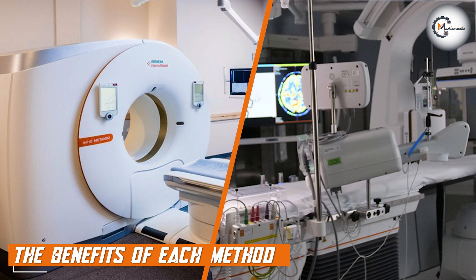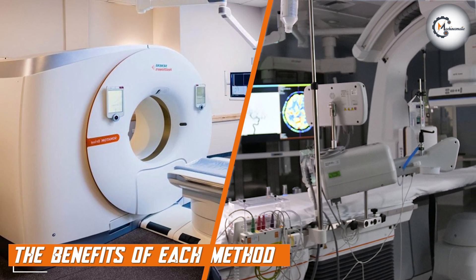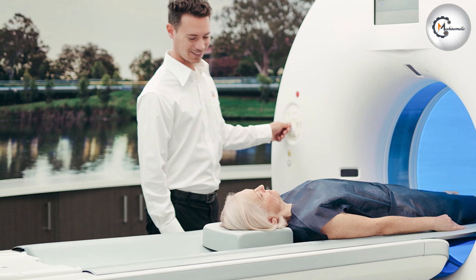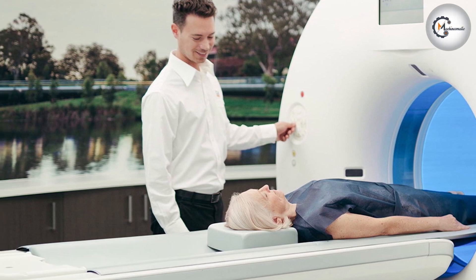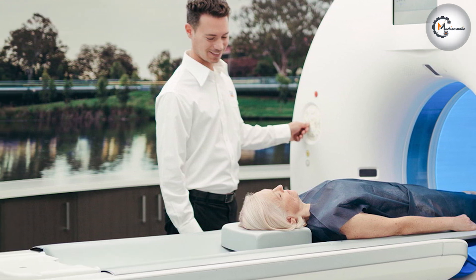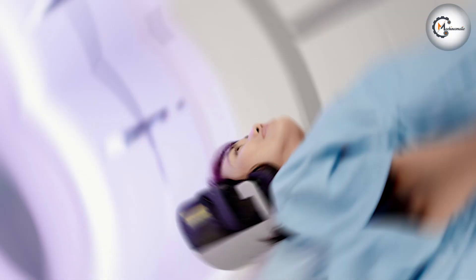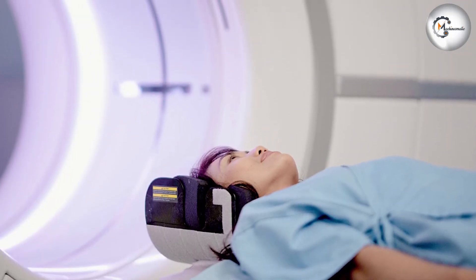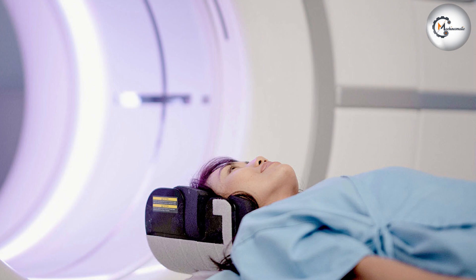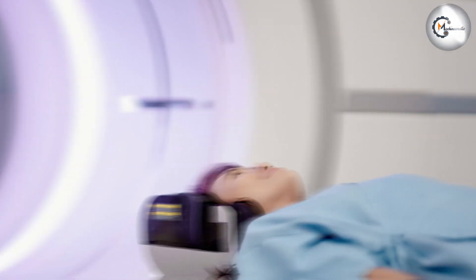While both the cardiac CT scan and the angiogram machine are used to diagnose heart-related problems, they each have their own unique benefits. The cardiac CT scan is a non-invasive procedure, which means that it is generally safer and more comfortable for patients. It is also a quicker procedure than the angiogram machine, taking only 5-10 minutes to complete.